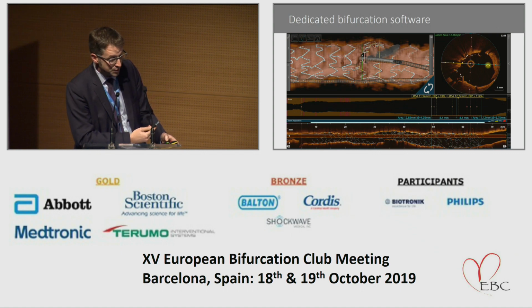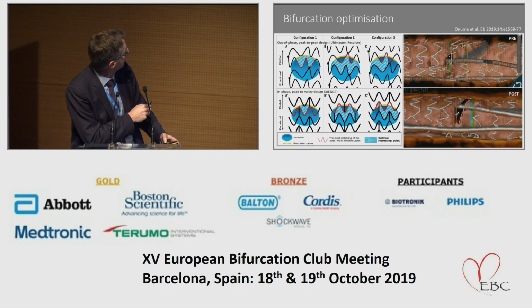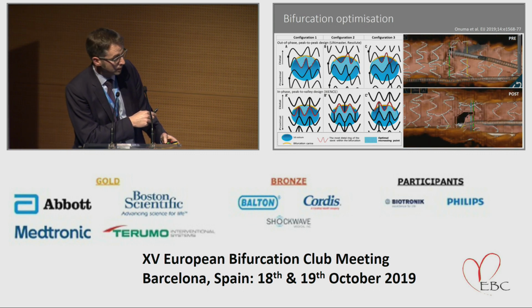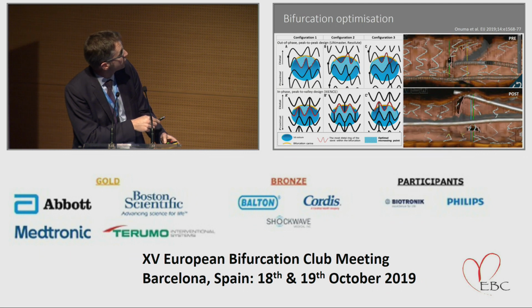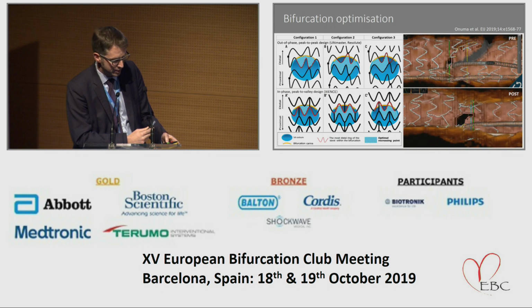I elected to accept the result that we had, mindful of the fact that we would still be left with maybe some margin of stent overhang. But actually when you compare the pre and the post, I think we've got very nice opening of the bifurcation, but there may be comment related to that.